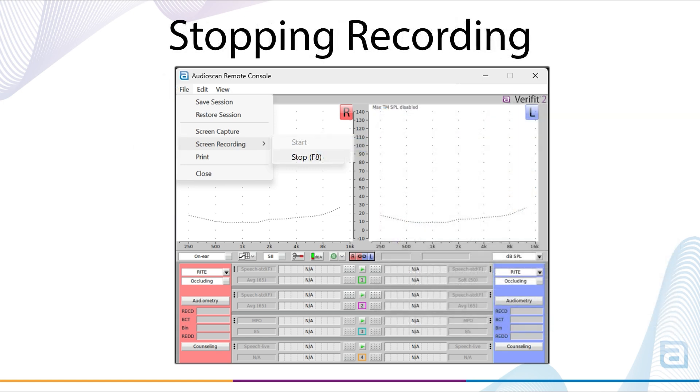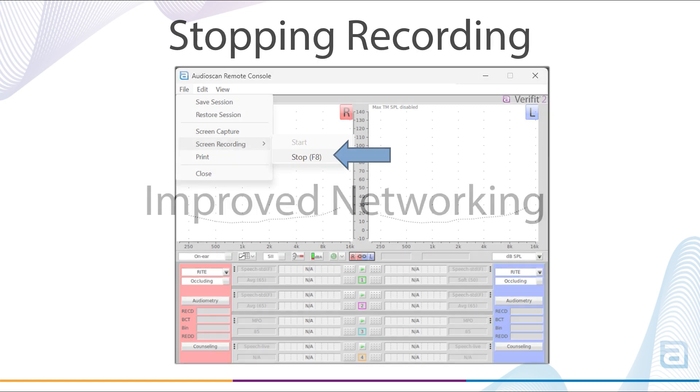Once you've finished recording video, select Stop within Screen Recording or use the F8 key to complete the recording.